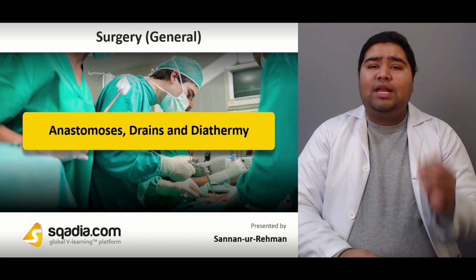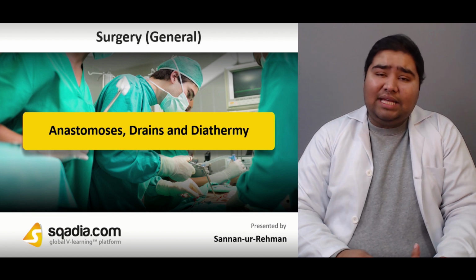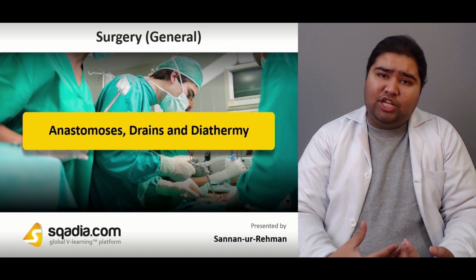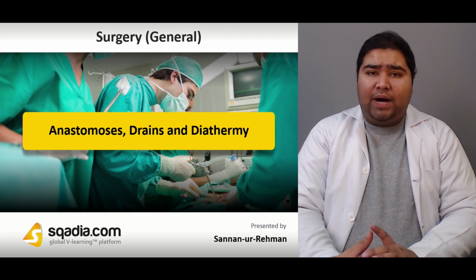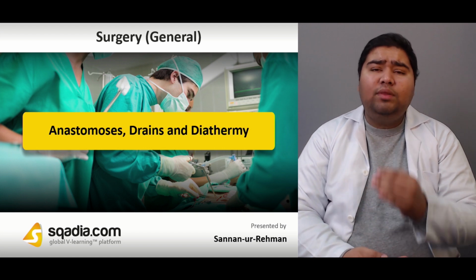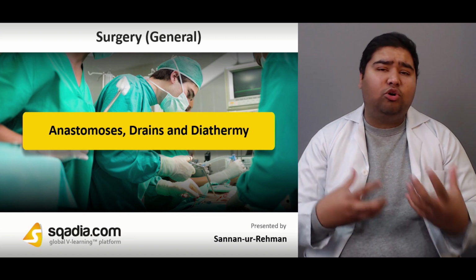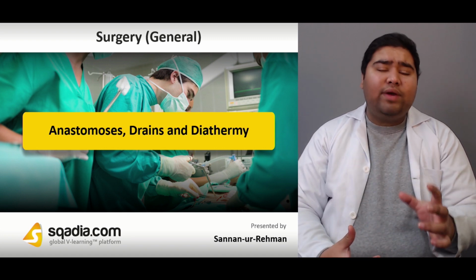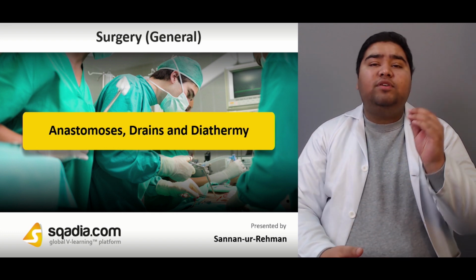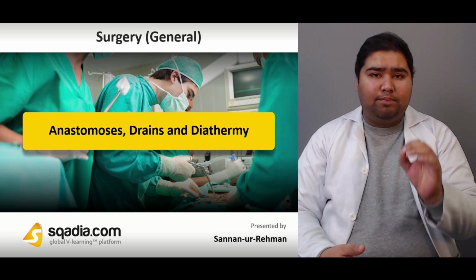You place the drain in your surgical field so that if there is any pus, if there is any leakage, if there is any fluid, it might be drained through that drainage tube into your drainage compartment. With that, you get an idea of how the surgery went and how well your anastomosis or your junction or your fusion was, and how airtight and watertight your anastomosis actually is. For some surgeries, drains are necessary. You need to place a drain there.